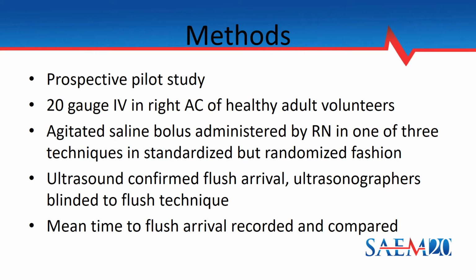Each of the flush techniques was performed 3 times on each participant for a total of 9 flushes per participant. A research assistant did the timing and the recording, and from this a mean time for flush arrival was calculated for each technique.